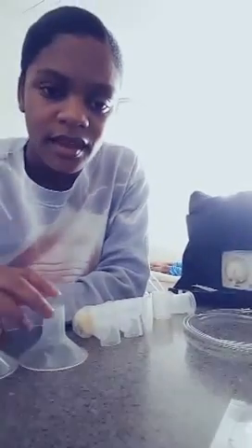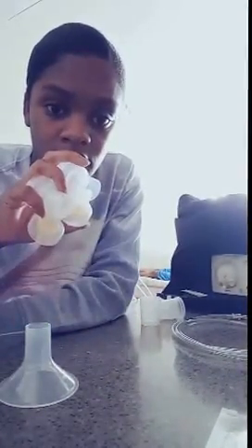Alright, good morning. Let's talk about how to get set up with our Medela pumps. So, I have the Pump in Style Advanced Dual Pump. And I got my breast shields, connectors, tubing.